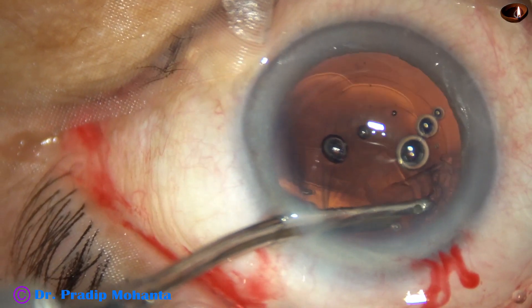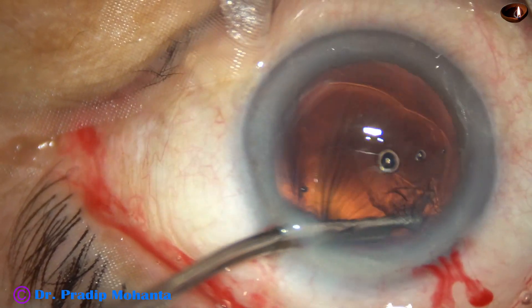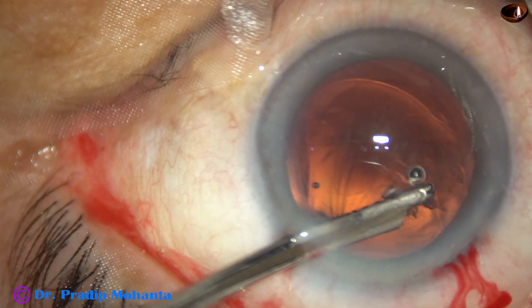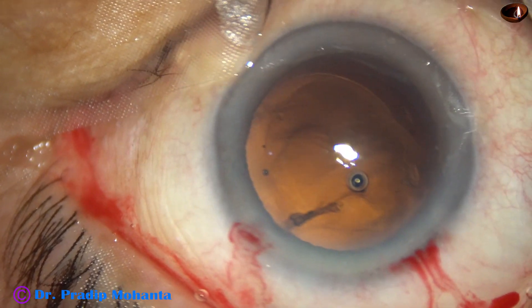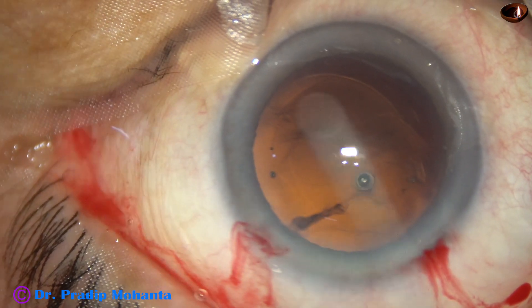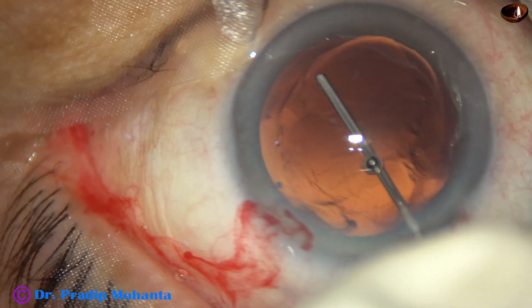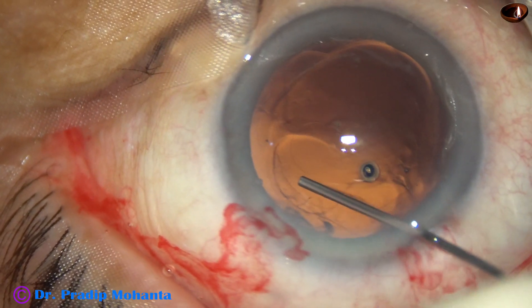Irrigation is not being used at this moment because I do not want to hydrate the vitreous. The cortex is nicely removed. Now I use Viscoat all around, fill up the bag, and make a space between the anterior capsular rim and the posterior capsule all around. My plan is to place the lens in the capsular bag.